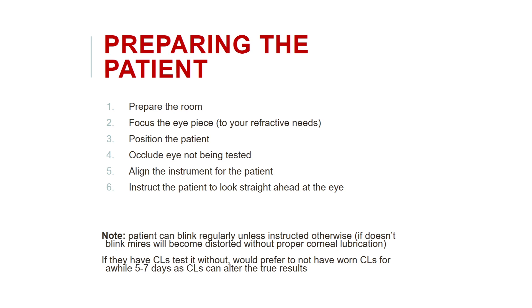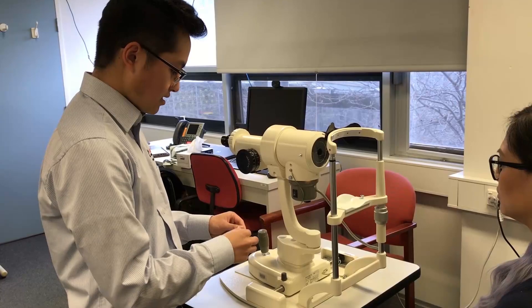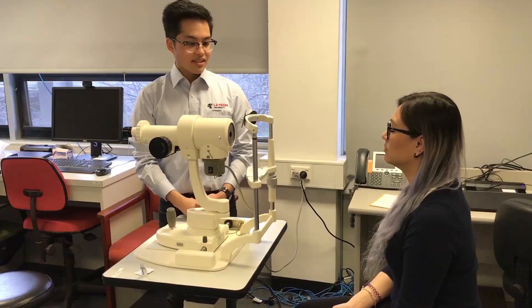Align the instrument for the patient — you can do this by looking from the side. You will see a tiny bright ring in the centre of the cornea. With the correct position established, the patient will see a reflection of their eye in the tube of the instrument. Instruct the patient to fixate on the reflection. When setting up the patient, remember to clean the equipment in front of them as it helps to reassure their care.